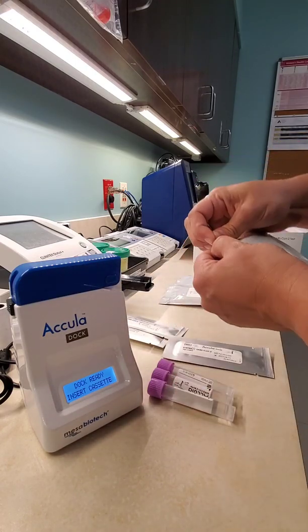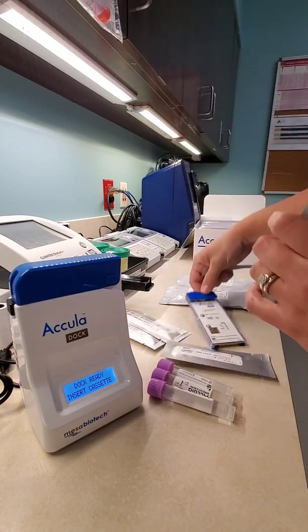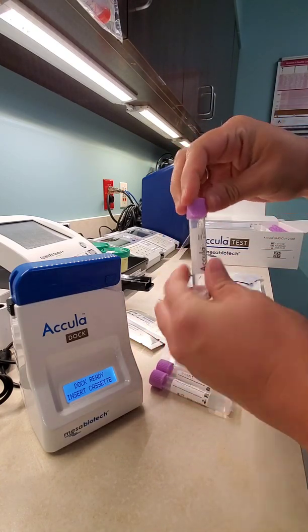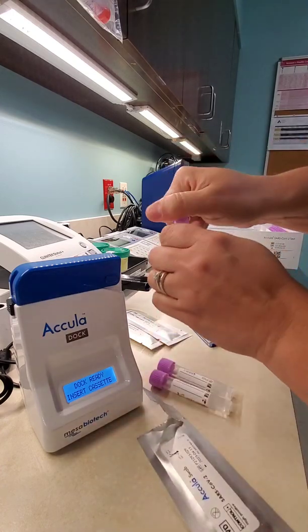What you'll do is you will open your cassette package up. This is what it looks like. It comes with the cassette and a small transfer pipette. You'll grab a buffer tube. I probably should be wearing gloves for this — wear gloves for a patient sample.